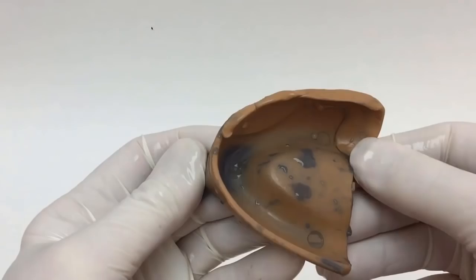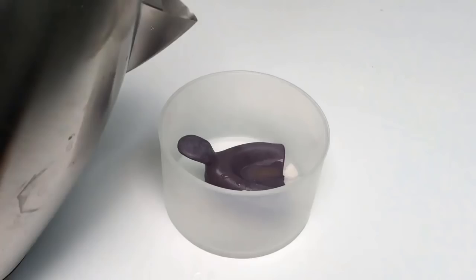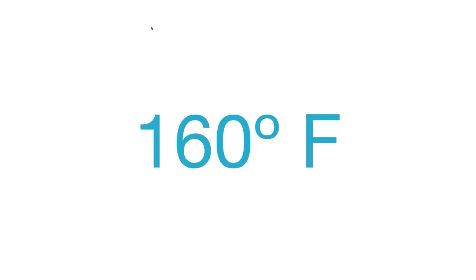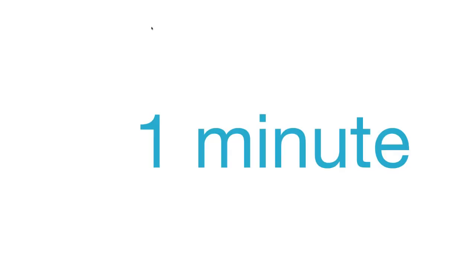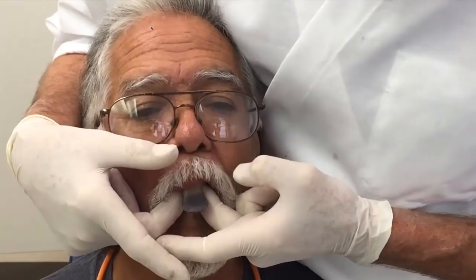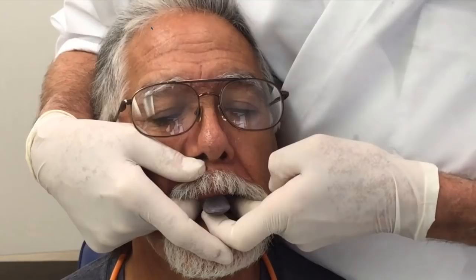Take the tray, which comes in its own little bowl, and pour in 160-degree water. Wherever the tray turns color, it's going to soften. Keep it in for a minute and time it — if you let it go longer the tray might become too soft; less than a minute and it might be too hard to manipulate. Take the tray, place it in the patient's mouth, and have them go through border molding motions: tightening their lips, pushing up into the palate. Then use the technique you'd use for a final impression. Take it out and examine it.